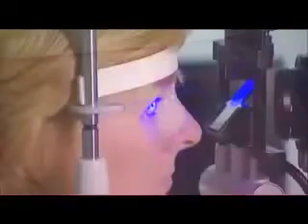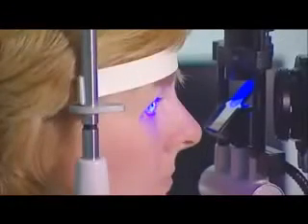The patient is asked to blink freely several times to distribute the fluorescein. Then the breakup time is read, first on the right, then on the left eye, and then staining is graded, first on the right and then the left eye, first on the cornea and then on the conjunctiva.